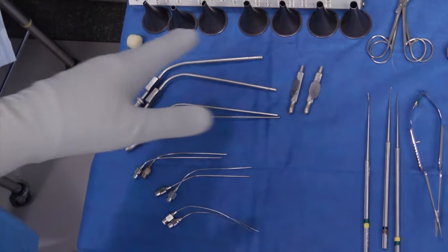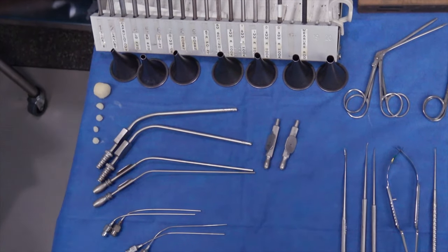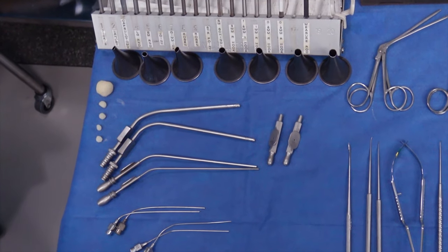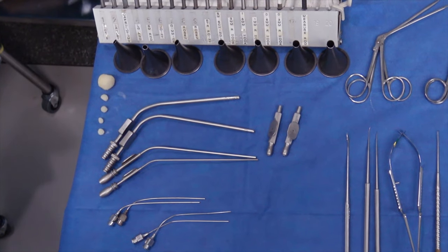These are different speculums. In general, when you're doing trans-canal ear surgery, you want to use the largest size the ear canal will accommodate — most typically that's a size six or size seven. The larger speculum you use, the better visualization and hand room and light you'll get down your microscope line of sight view.